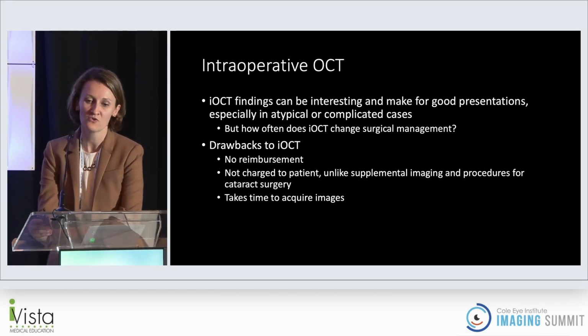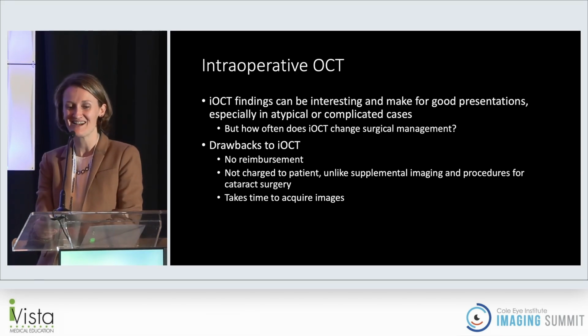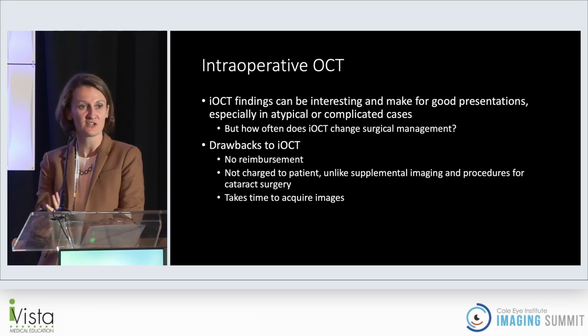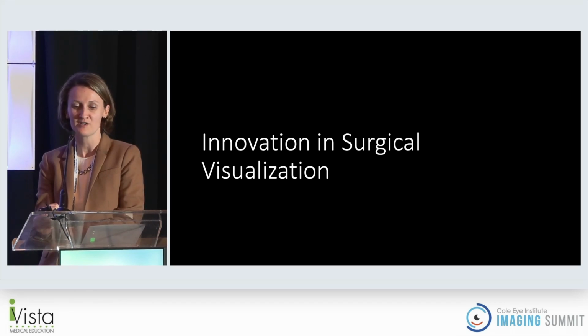Although intraoperative OCT can be interesting and make for good presentations, there are certainly drawbacks as well. There's no additional reimbursement for it. This is very different from our anterior segment colleagues, where we often charge extra for supplemental imaging and boutique-like procedures, and it takes time to acquire some of these images.